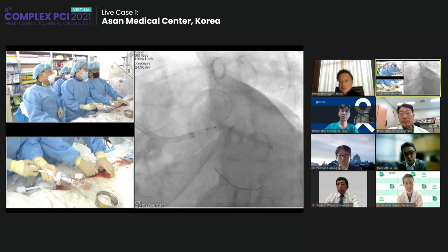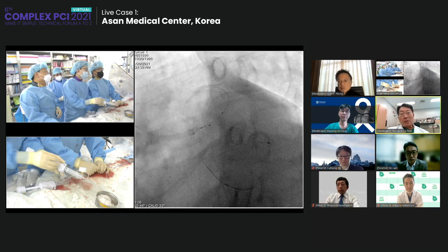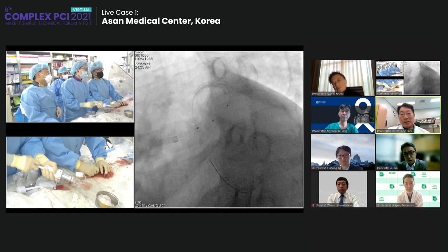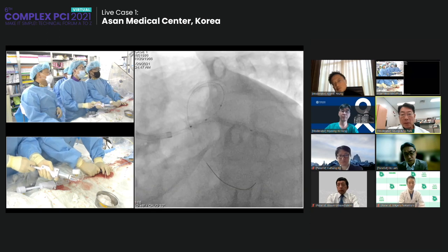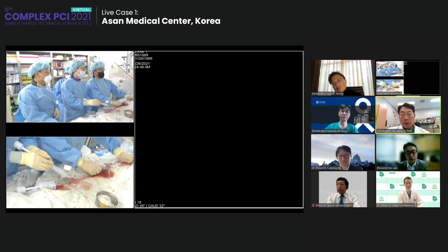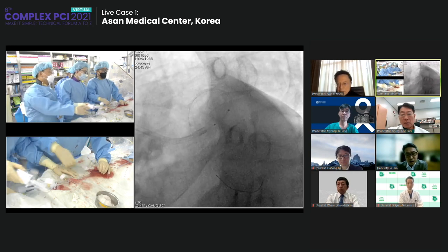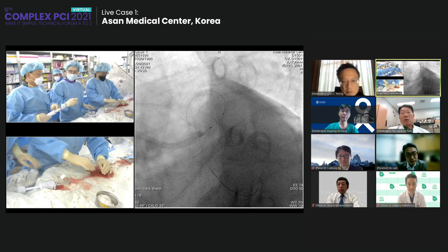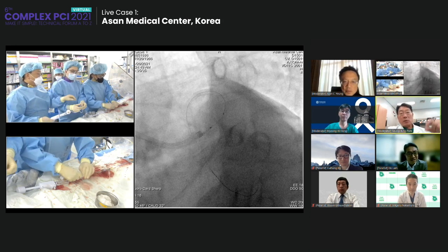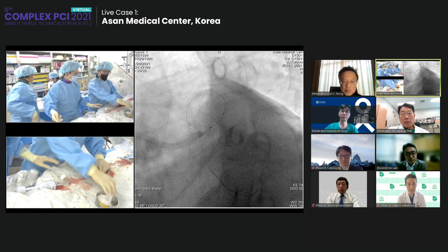Okay. Deplete. All right, a very small difference. Yes, go. Why not? We were talking about technical aspects. So at this moment, I prepared some technique, a 3.0 NC balloon over here. Previously, what size of stent? This is a 3.0 by 28, the giant.